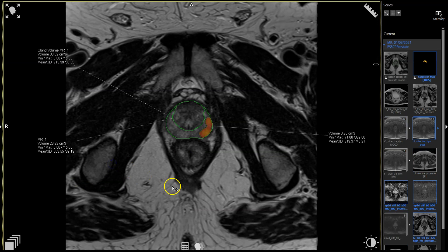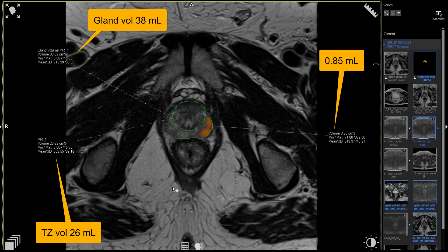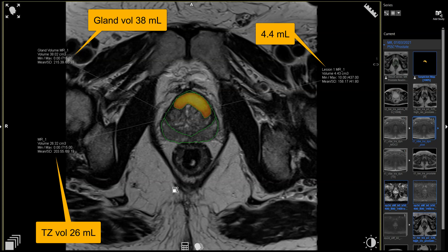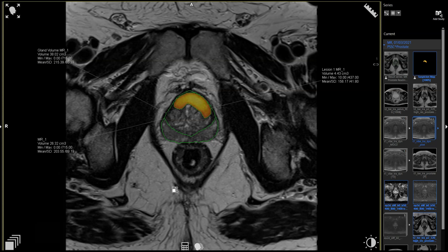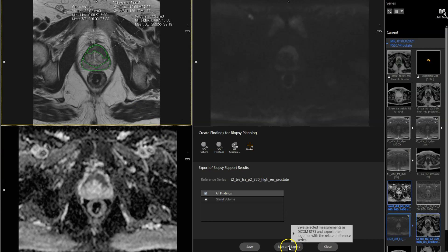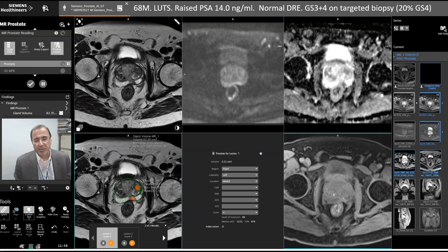We need to look at the segmentations. The apical lesion is about 0.8 cc, the anterior fibromuscular stromal lesion is about 4.4 cc, and the total glandular volume is about 38 cc. We can output these contours for biopsy purposes by exporting the images as a DICOM-RT object.